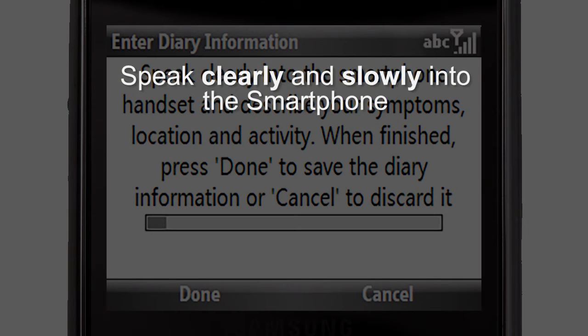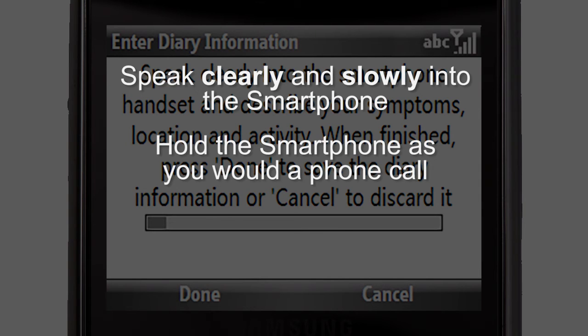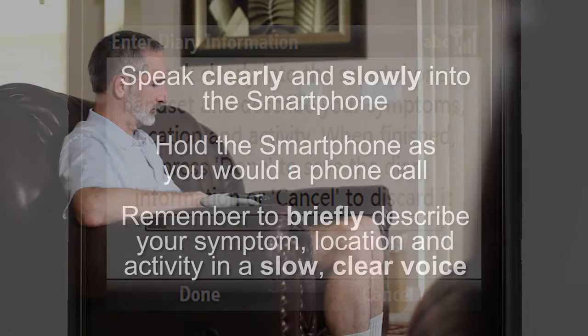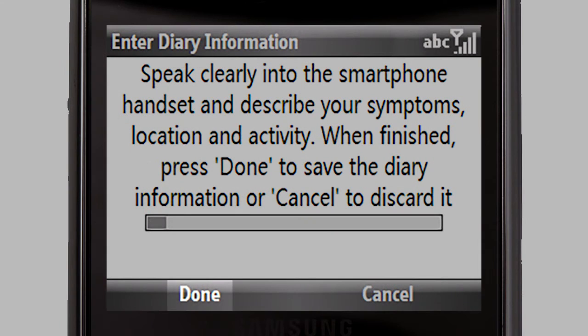Speak clearly and slowly into the phone. Hold the phone in the same manner you would if you were placing a phone call. Please remember to briefly describe your symptom, location, and activity in a slow, clear voice — for example: 'Skip heartbeat, watching television at home.' When you have finished your voice recording, press Done with the left soft key.